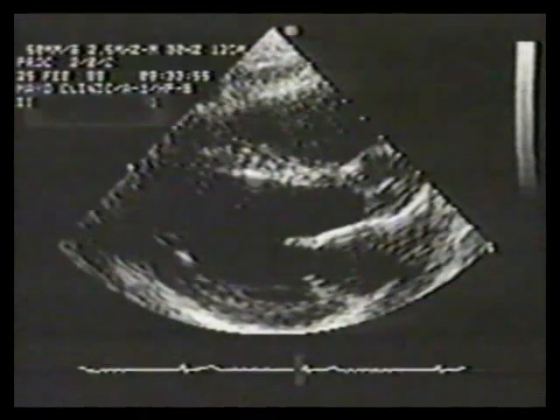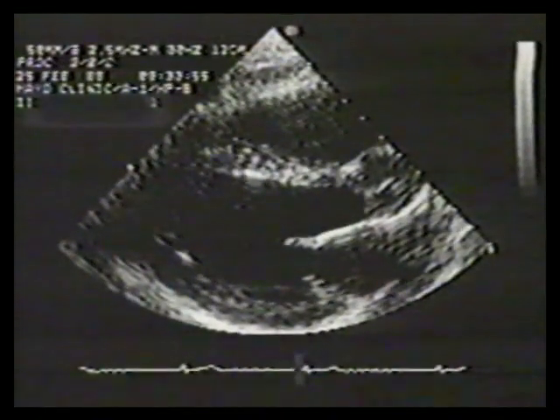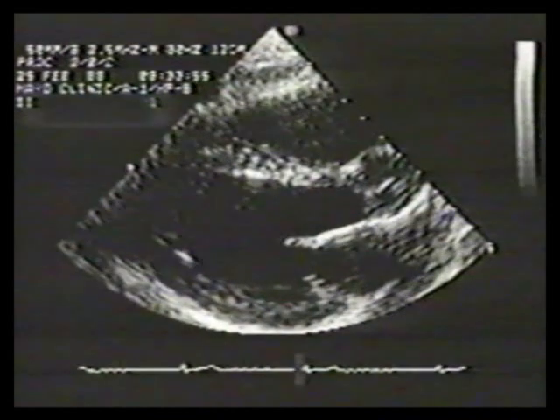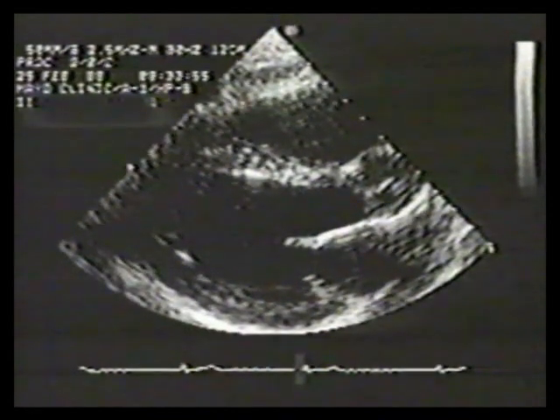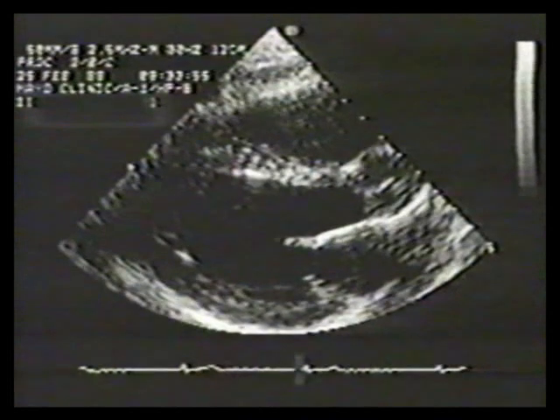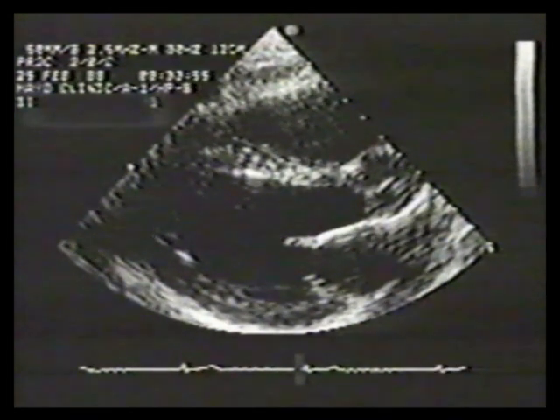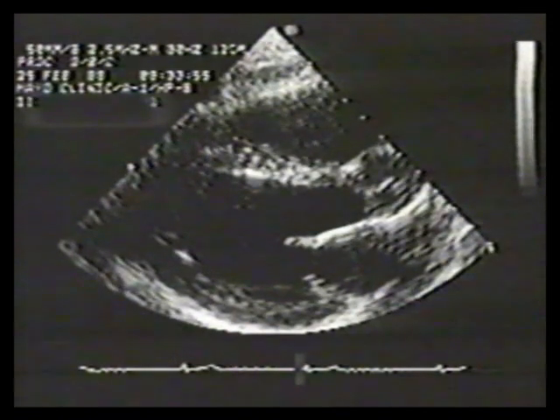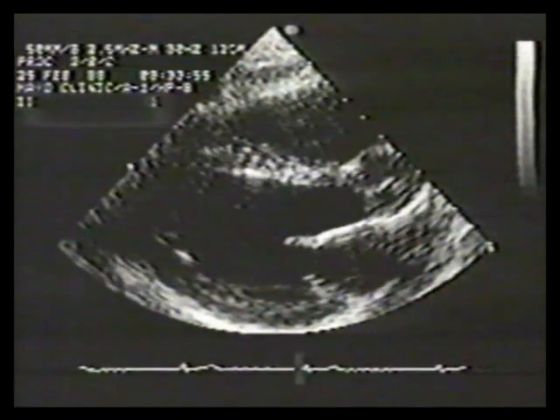Complete and accurate pulsed wave mapping is extremely tedious. Color flow imaging provides a much more efficient means for semi-quantitating mitral regurgitation. We will now show examples of varying severities of mitral regurgitation as assessed by color flow imaging.